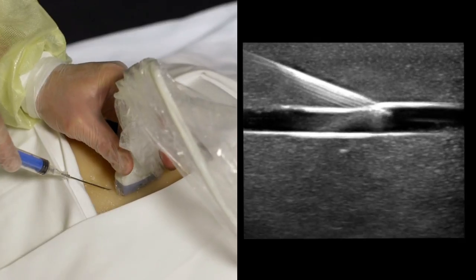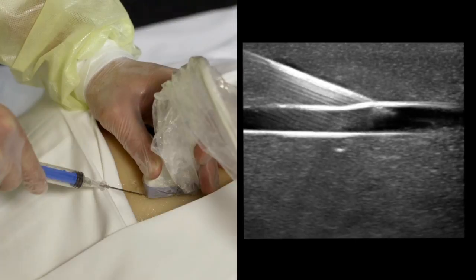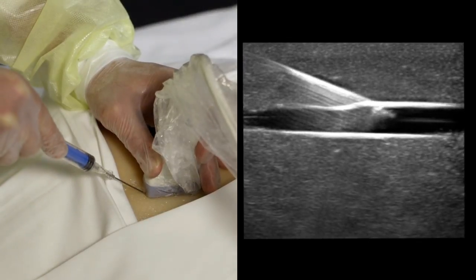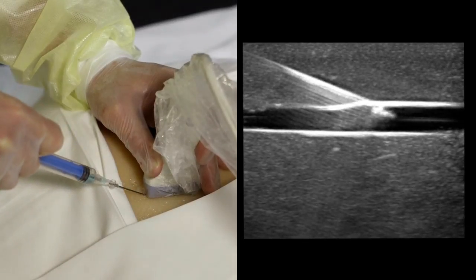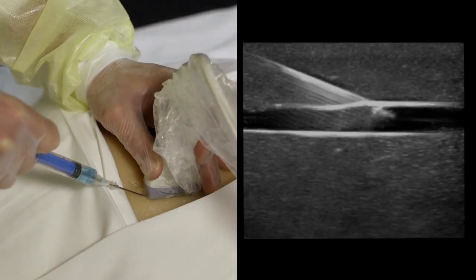Once you are entering the vein, turn your gaze from the screen to the needle and confirm vein entry by noting the flashback of blood. Use your clinical skills to confirm venous rather than arterial placement by checking for pulsating flashback. At this point, you can put down your ultrasound probe and proceed with the central line insertion as you normally would.